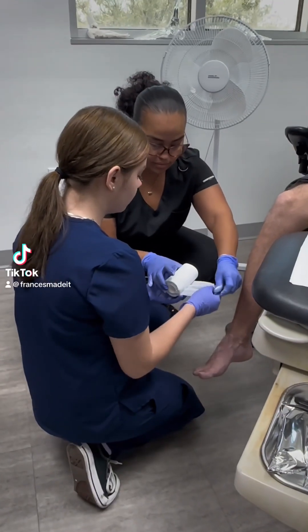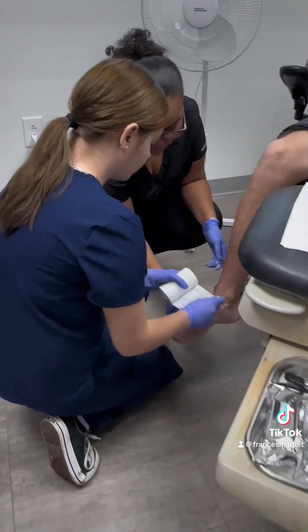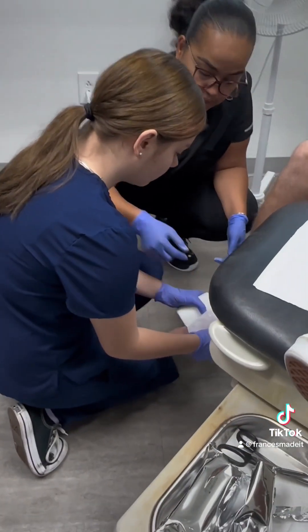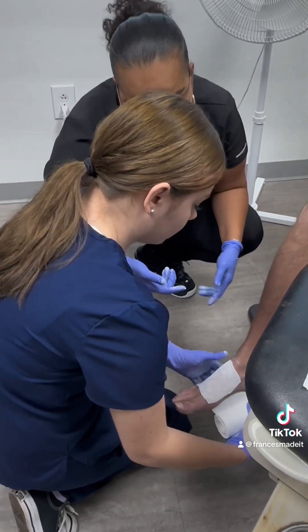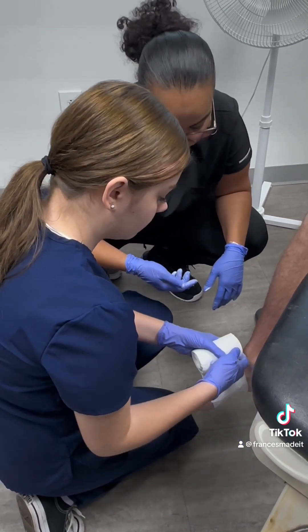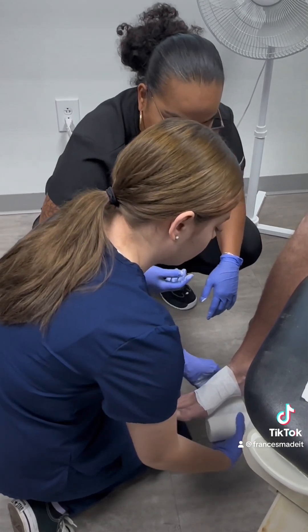Place this against the body so the forefoot doesn't cover your toes right here, because you don't want this to swell up. This is used for edema and swelling. Be very neat. I like to do twice around my forefoot and midfoot twice, and then I like to do a figure eight to give them some stability.